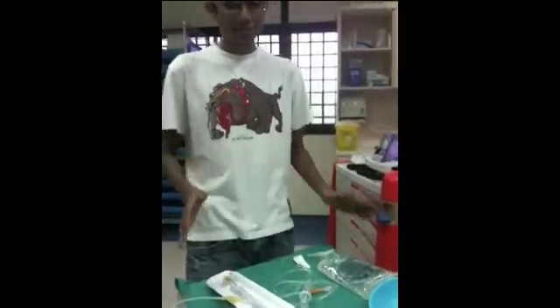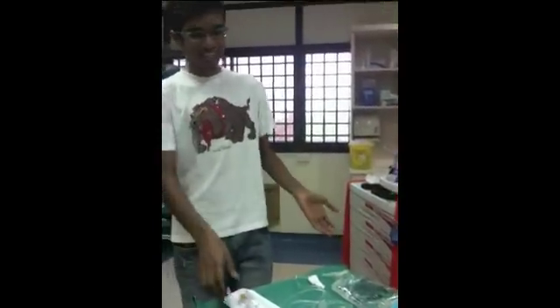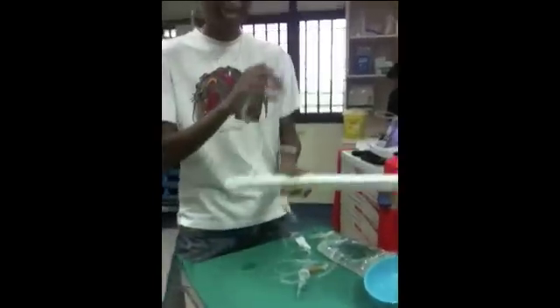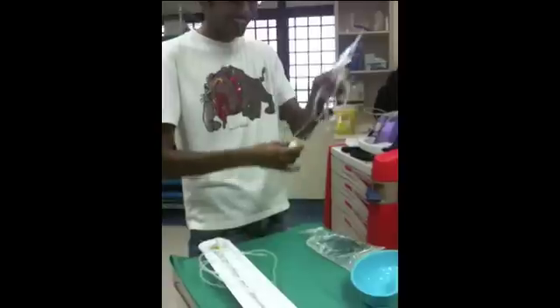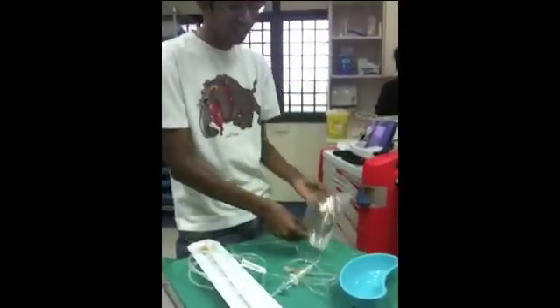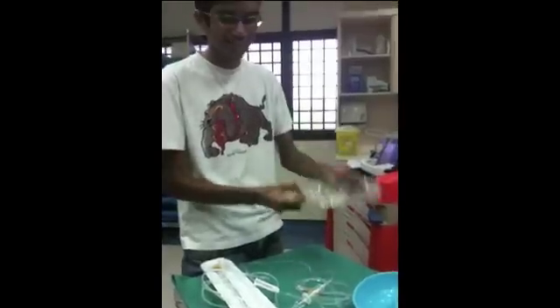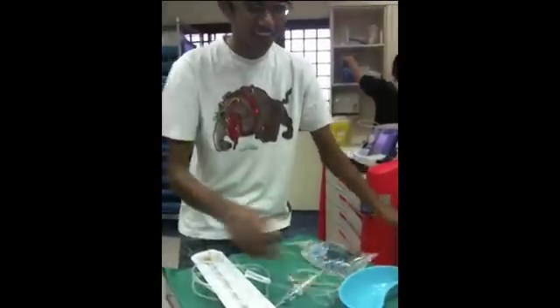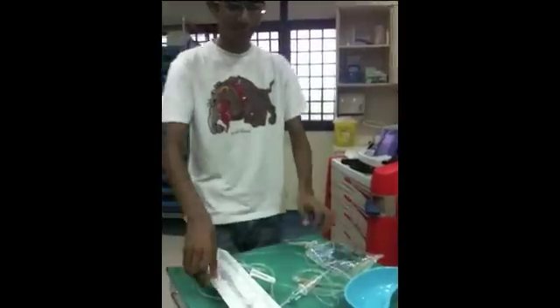After that, I'll wash my hand and start to prepare my equipment. So this is my equipment: first, we have the water manometer with the tubing; second, we have IV tubing; and third, we have sodium chloride 0.9%, a kidney dish for this procedure, and don't forget the apron.